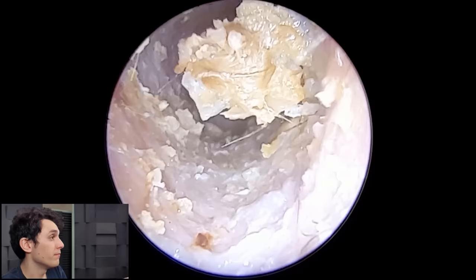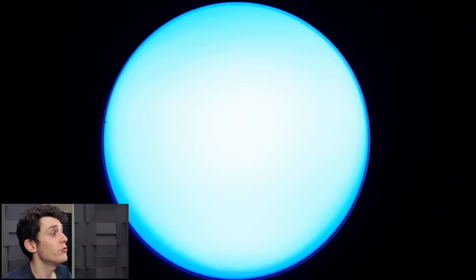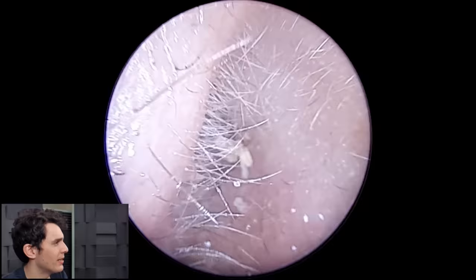So one of the appropriate treatments for otitis externa is sometimes not just medication but also cleaning the ear — and that's what we've achieved here. We've removed two huge chunks of dead skin, and there are a few small remaining pieces.